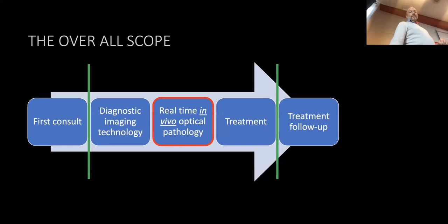But you still have to wait for about 6 weeks before you get this treatment. So what we actually need is to really speed up this diagnostic process in order to make sure that the patient is qualified for this. So you will have what we call a one-stop shop. And with normal biopsy, harvesting and analysis, that's very time consuming. You have to create those microscopic slices.